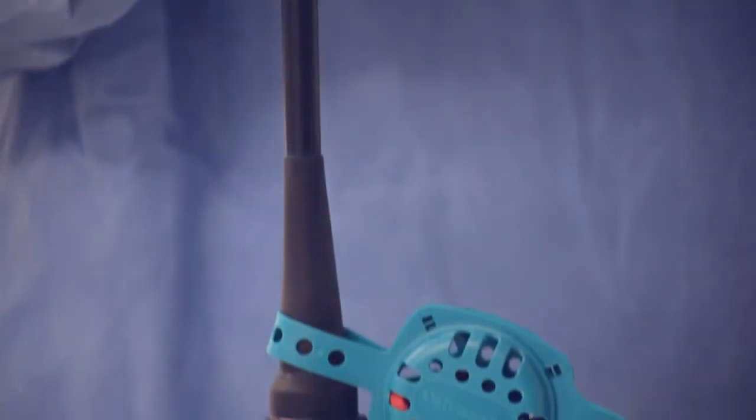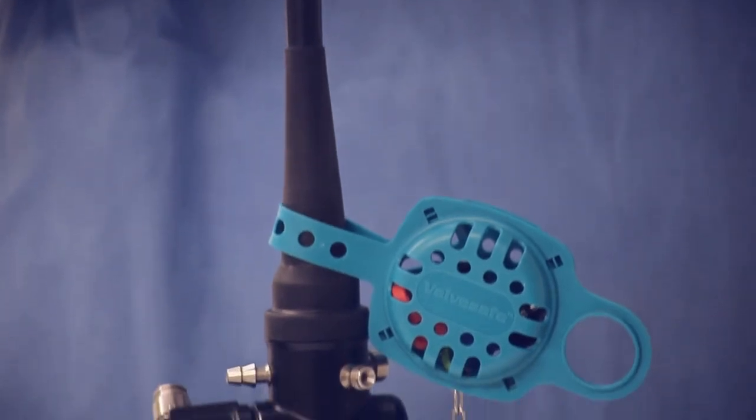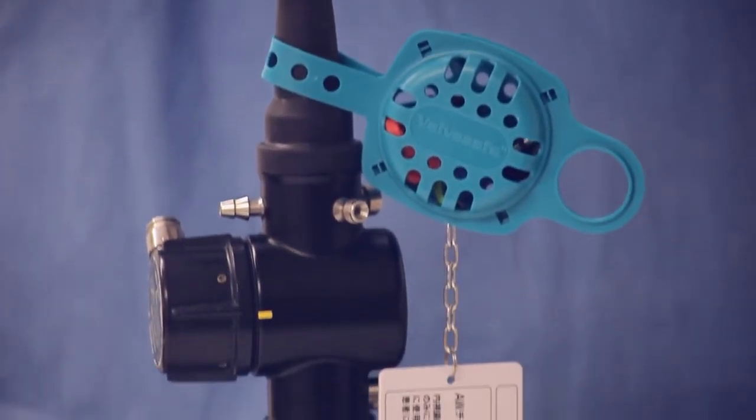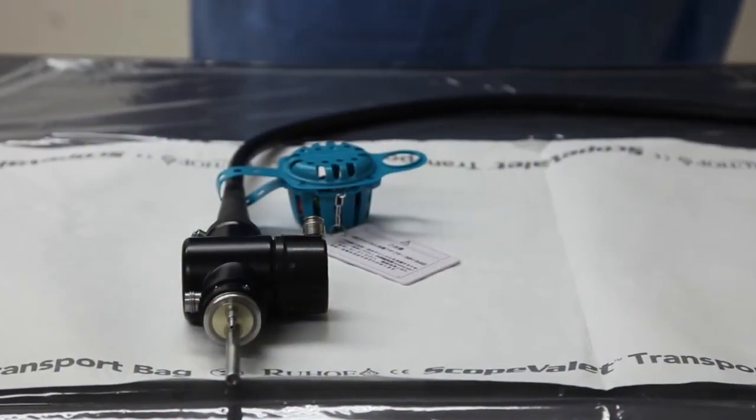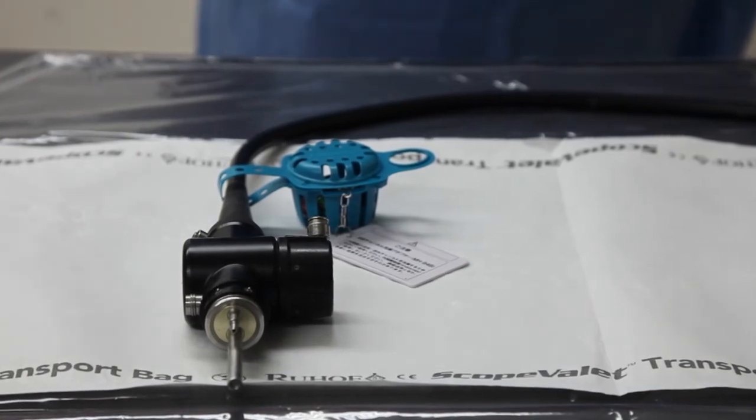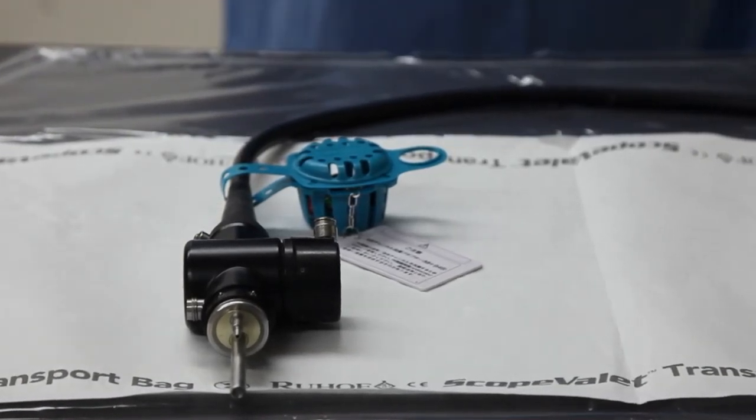ValveSafe remains on the endoscope after the AER process and continues to remain on the scope during any storage in a drying cabinet and transportation via a tray system. The ValveSafe should remain on the scope until the scope is taken back through to the procedure room and is ready to be used again.